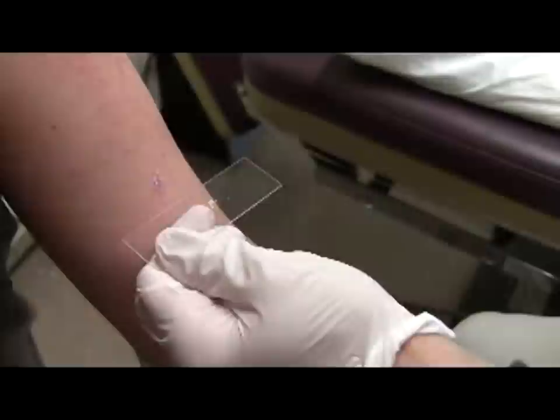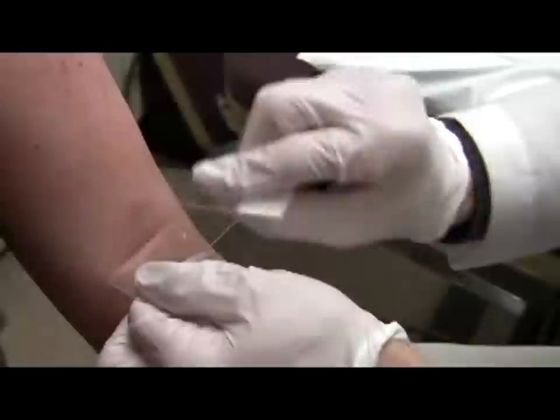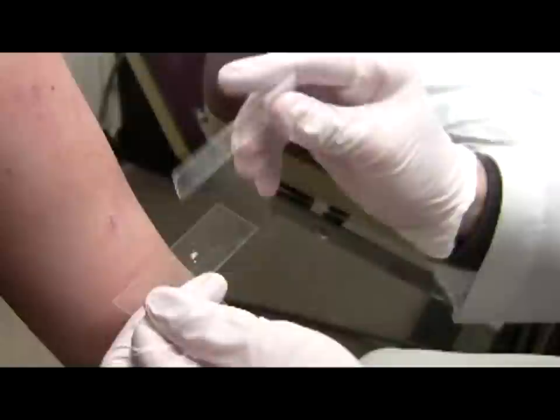Just hold on one second, grab another glass slide. Another way of doing this is to take another glass slide and generate scale that way. And now it's good because you can transport the materials.